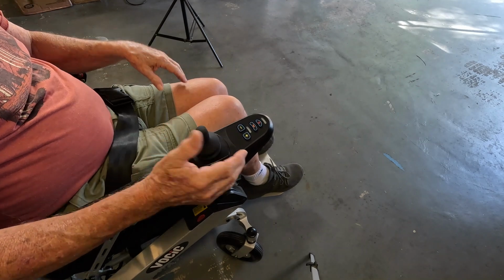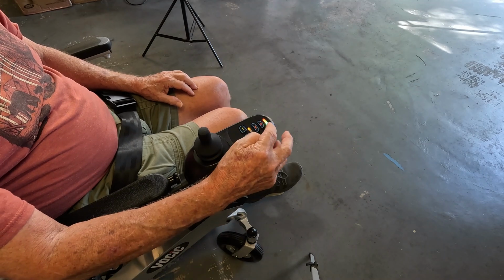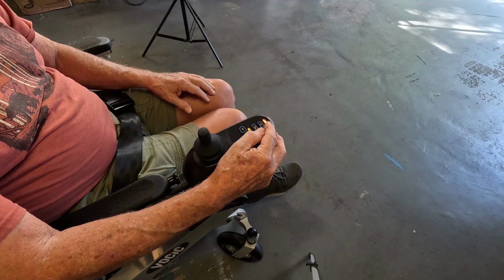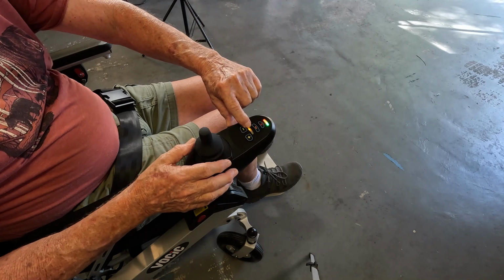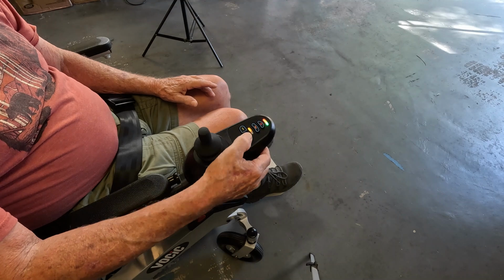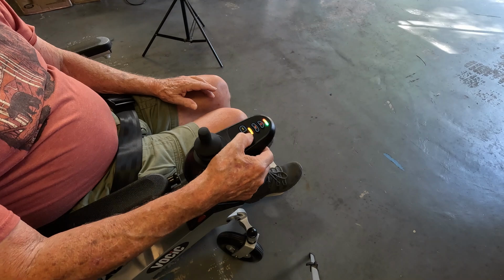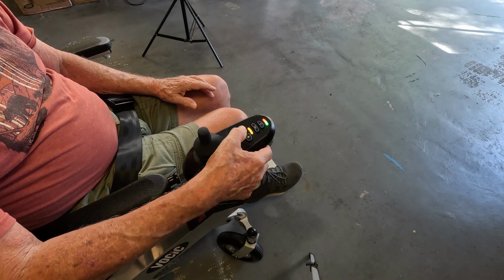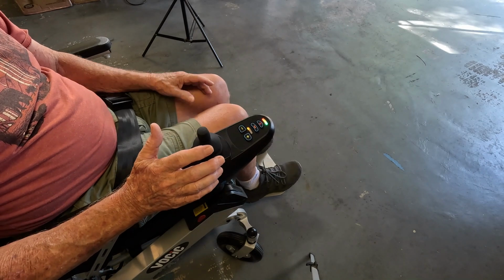All right, now let's turn her on. 1 second. There. And there is the indicator. The battery is fully charged and each light is 20% charged. And you see I'm on the lowest setting right there. So this is going to be very slow. If I want to go faster, I can just go up, keep going. And that's the highest speed right there. That's the full 3.75. So I'm going to just go slow at the beginning.